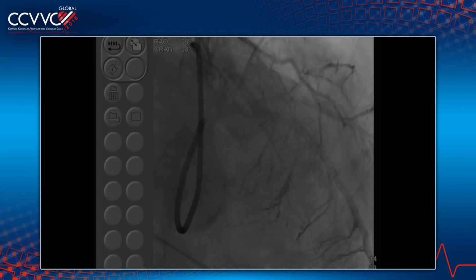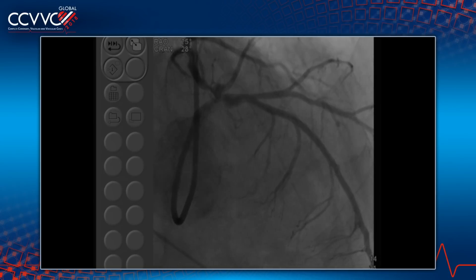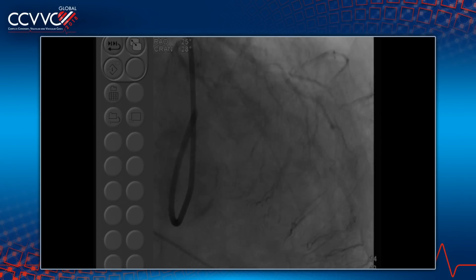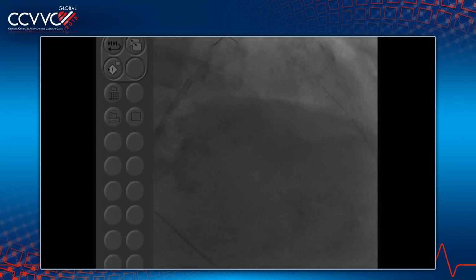What to do with this calcium, after the valvuloplasty? Okay, stop right there. Severe aortic stenosis, a 94-year-old person with a severe left main trifurcation lesion. Dr. La Sala, how do we approach this? Obviously a chunk of calcium sitting there. We're putting together a series of people who have high-risk PCI in conjunction with their aortic stenosis. This is obviously not too atypical.